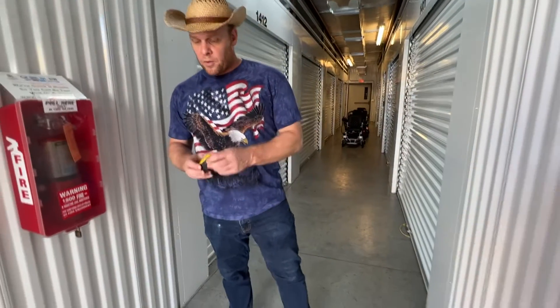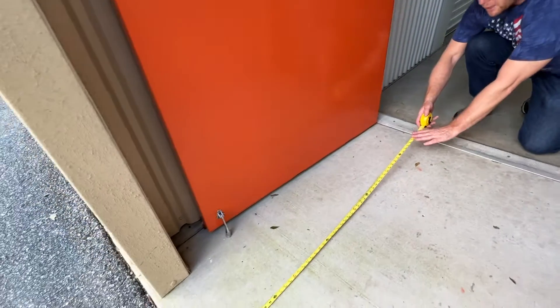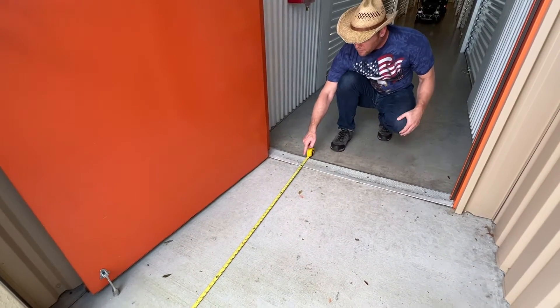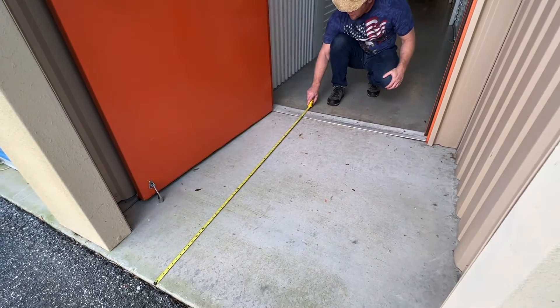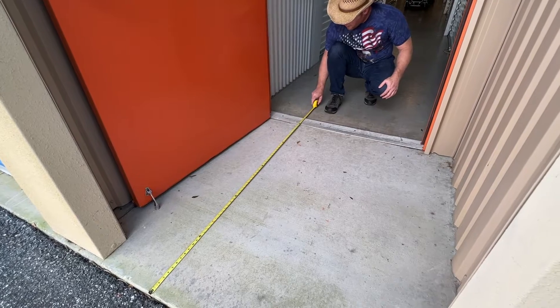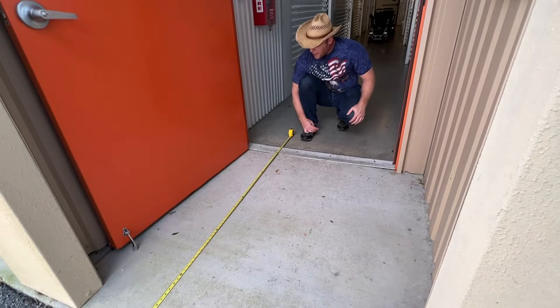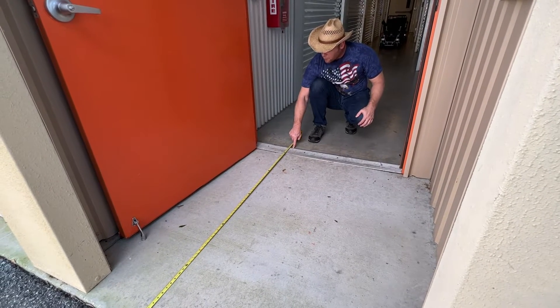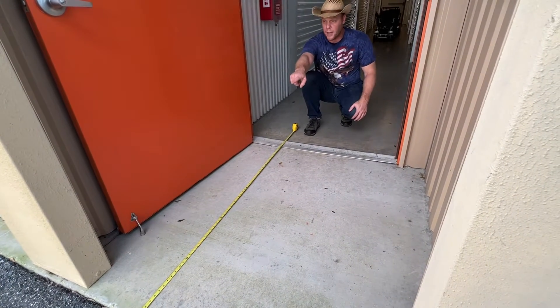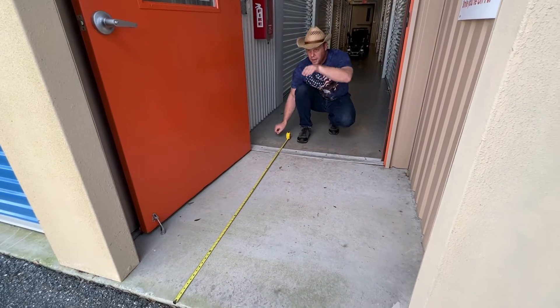I'll explain the rules of engagement here. We've got about 65 inches — close to five and a half feet — where we're going to let off the gas on the front wheel. Then we're going to see how long the chair takes to stop from full tilt before we get to the end of the little hallway. And then there's a hill that goes down at the end.